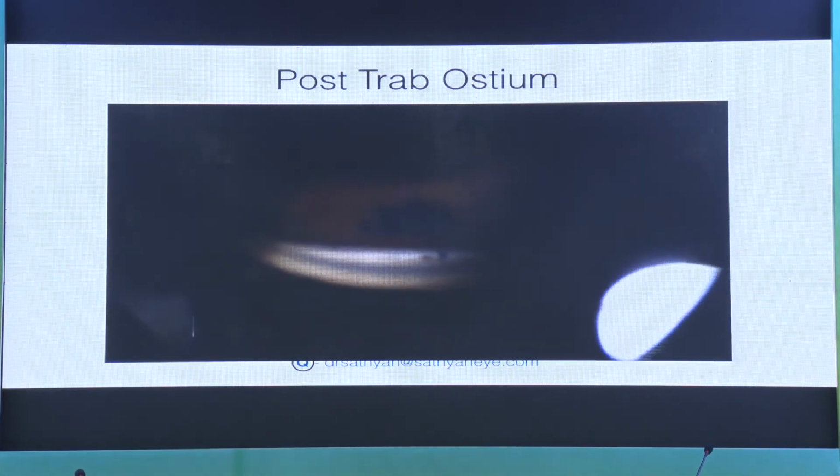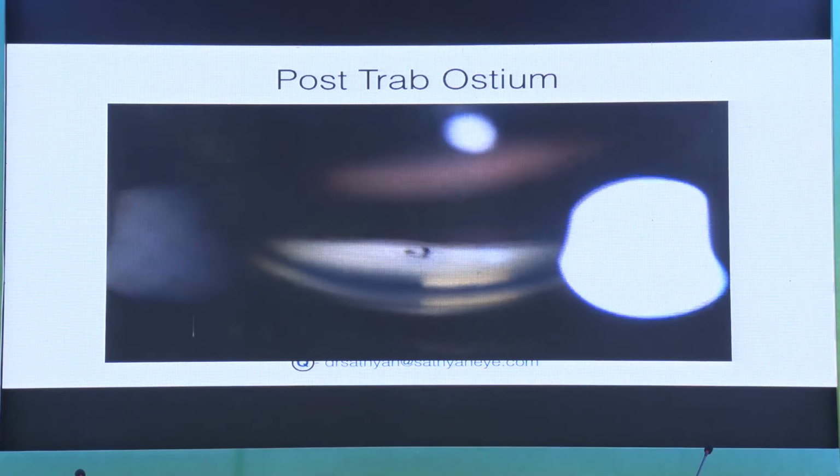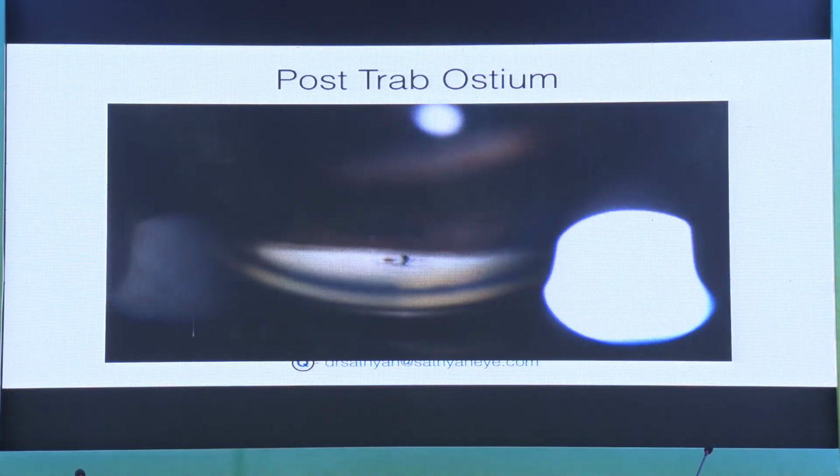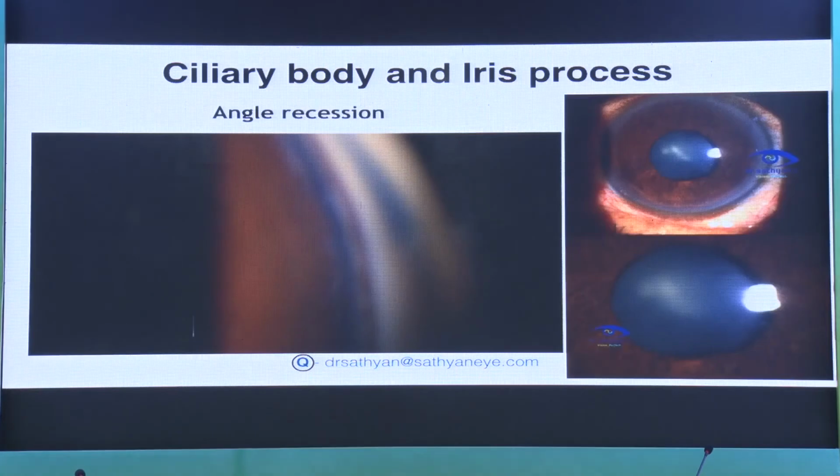You can see a small pigmentation in the ostium, but the ostium is still open, a patent ostium. So you can always go ahead with that. This is not the reason for the blockage; this is basically the scar formation.